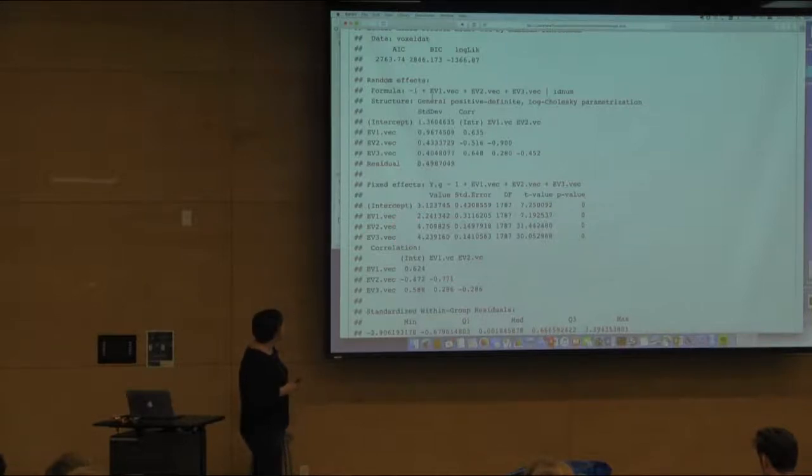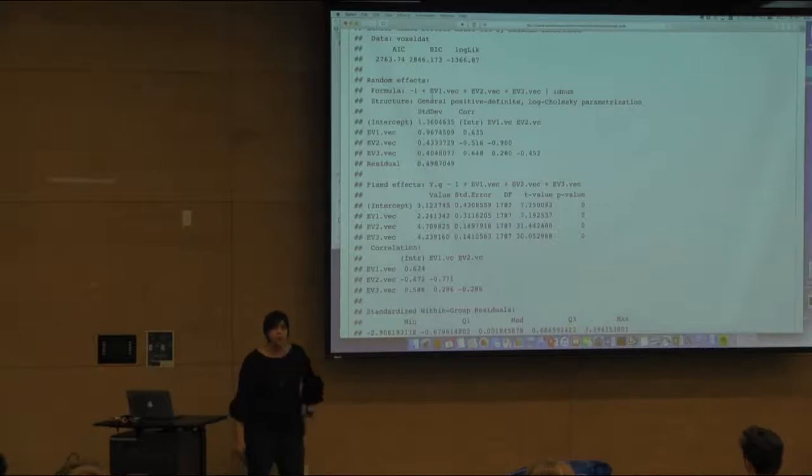So we don't actually care whether this EV1 or EV2 or EV3 is greater than 0 or not, right? That's what this is. This is telling you, are these significantly different from 0? And if so, what are their values? What we care about is actually going to be the difference between EV1 and fixation, which is the intercept, or EV2 and EV1, right? And that's what the contrasts are that we create, right? So the significance of these just tells you, are these different from 0? And yes, they are.